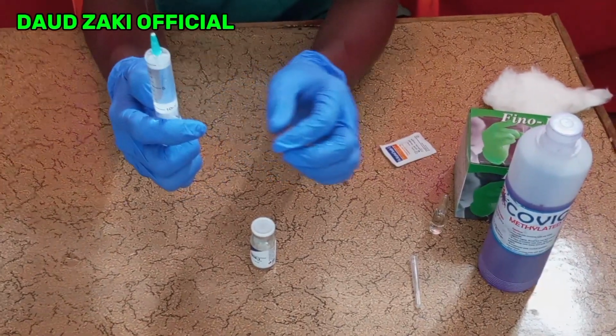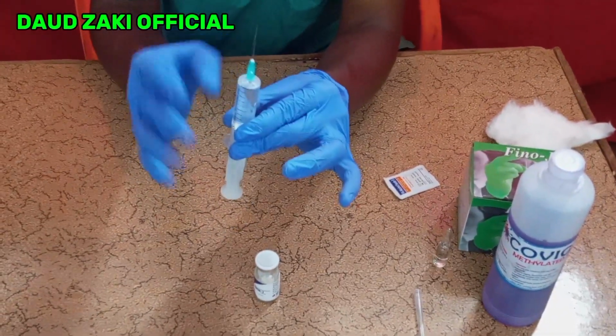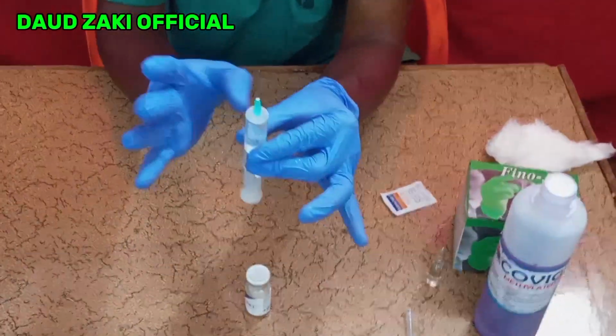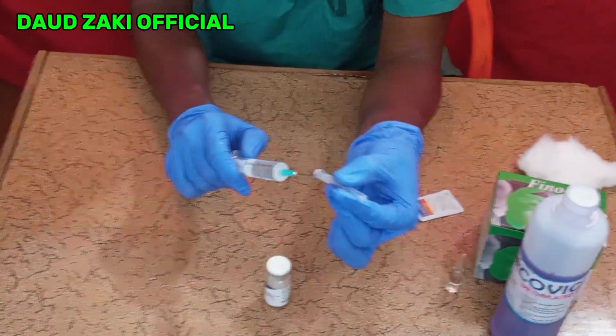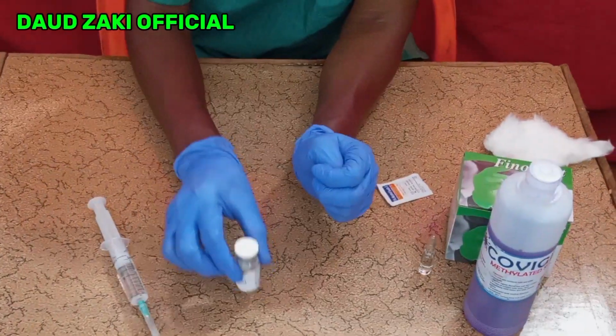You have to push the plunger and tap the syringe to remove air bubbles. You have to remove air bubbles first. Make sure you put the cap back on the needle to avoid contamination or injury. And this is our vial.